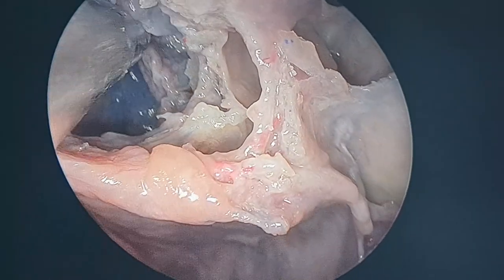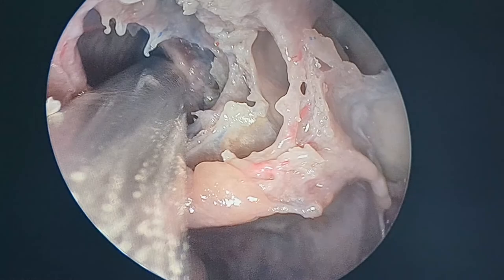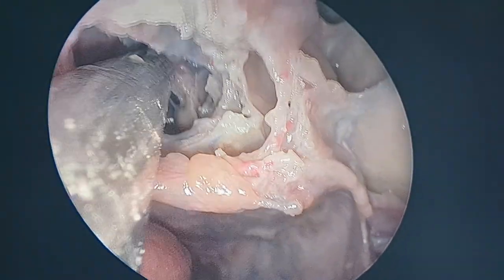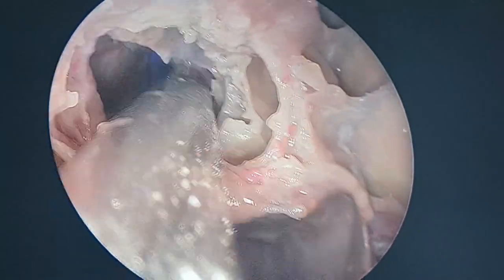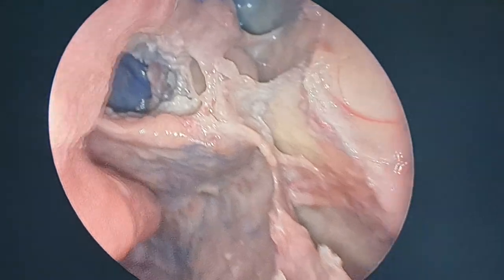Stay between the superior turbinate and the nasal septum. This is the nasal septum there. Now where to look for the sphenoid sinus again? Again, why am I saying life-saving line, this maxillary line and life-saving line? Follow the maxillary line. See this maxillary line again.